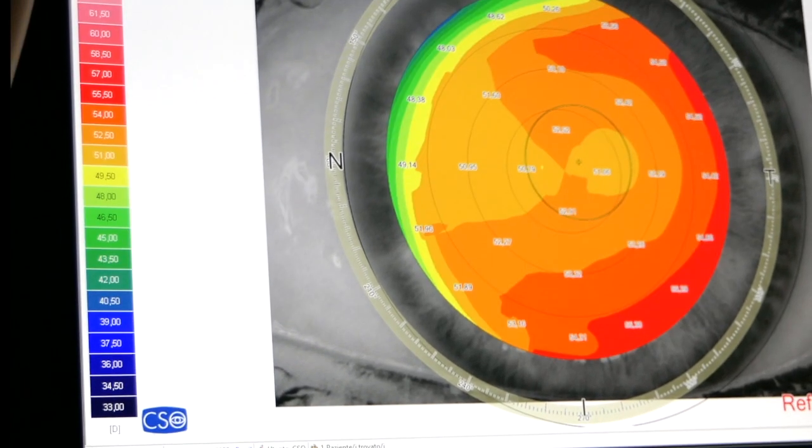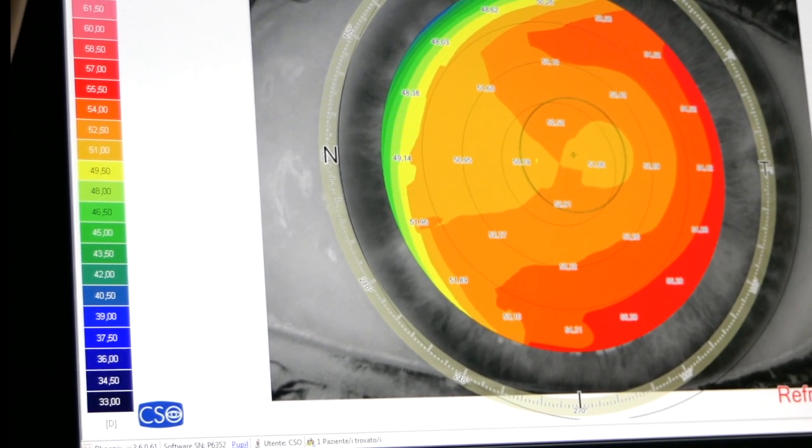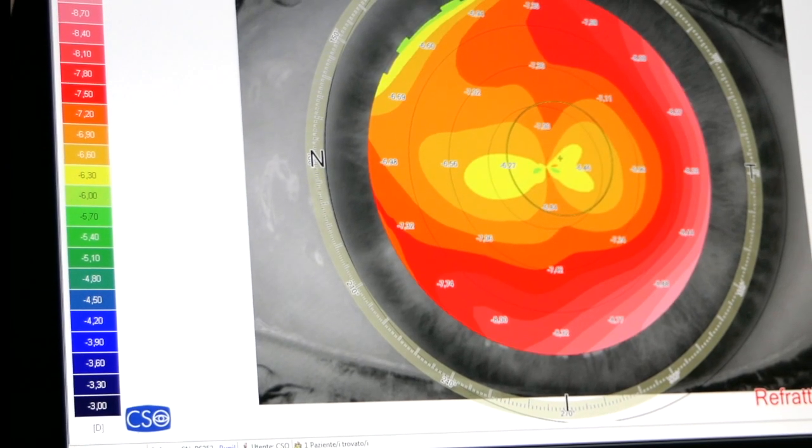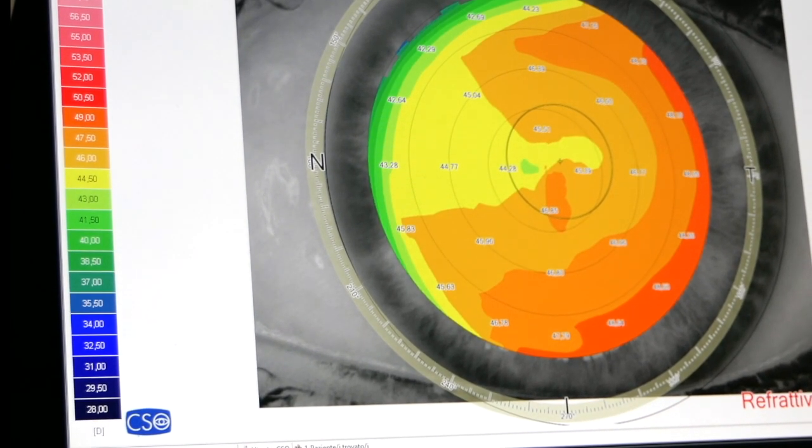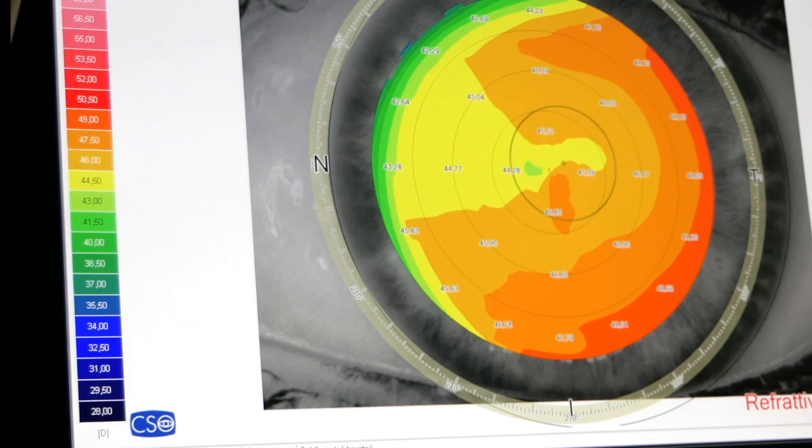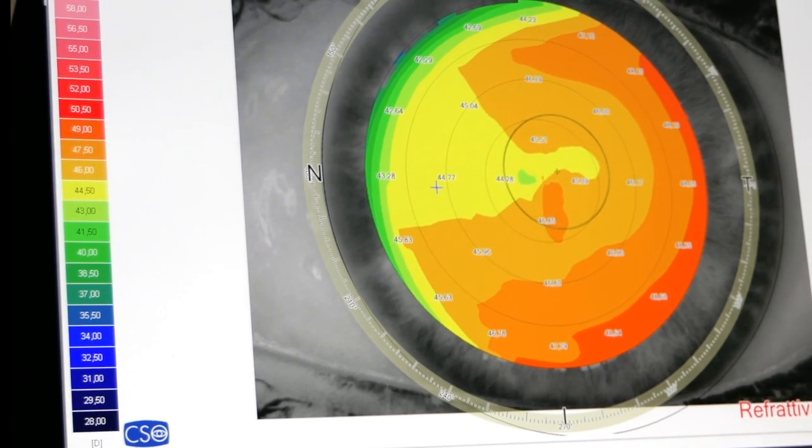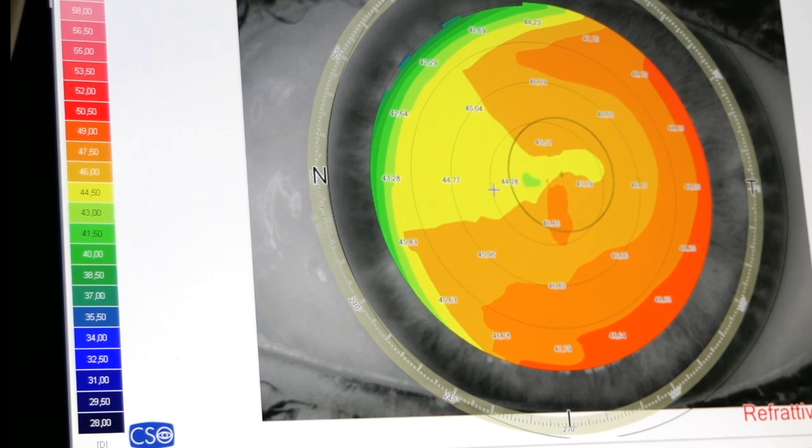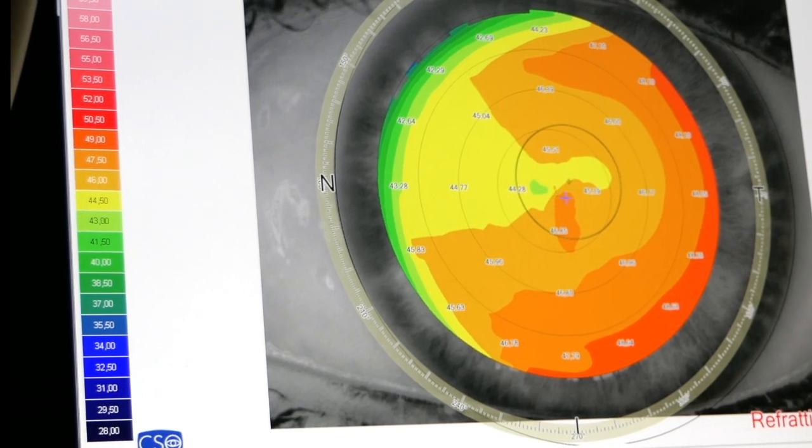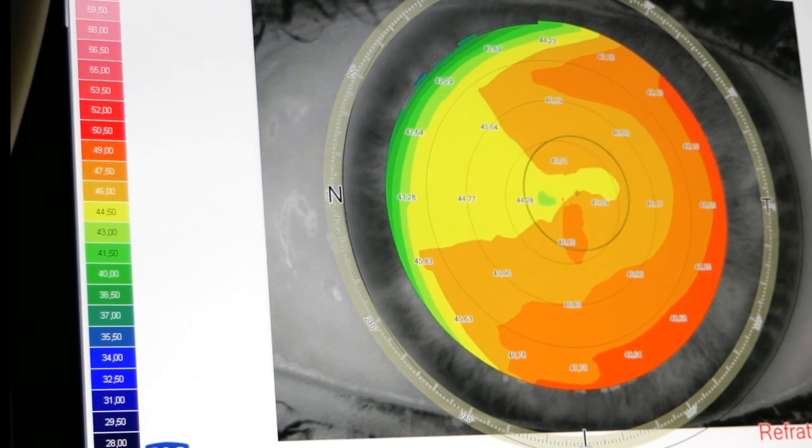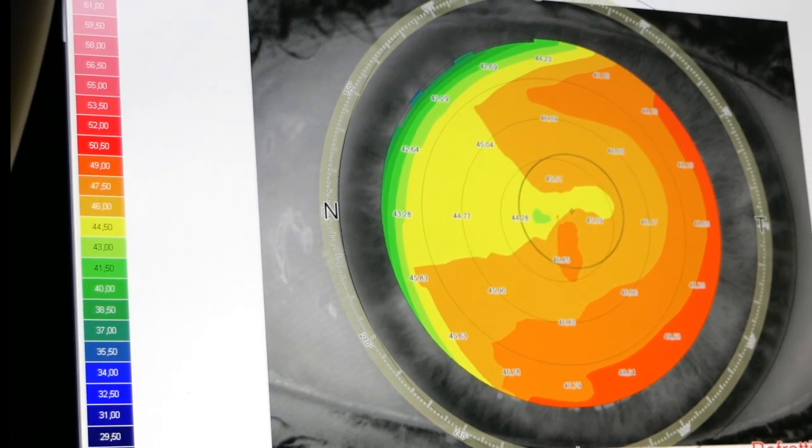Then there is the anterior, posterior, and equivalent refractive elaboration, in which the fact that the cornea is considered in each point in diopters, that is a lens with a given power in that given point, is taken all into consideration.